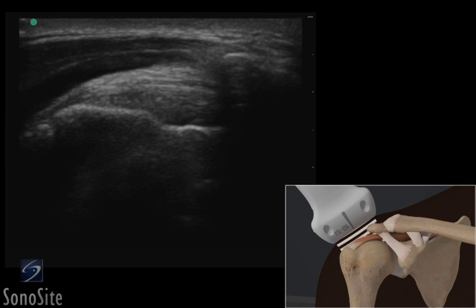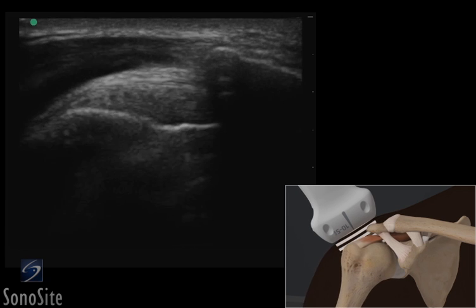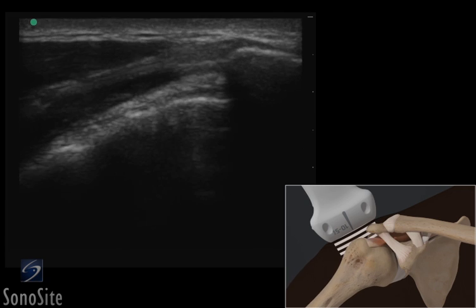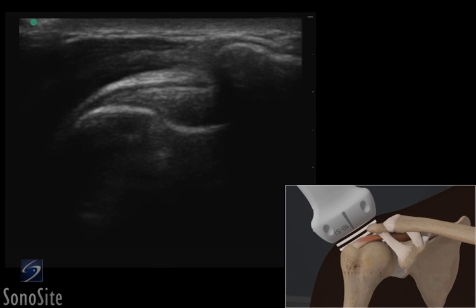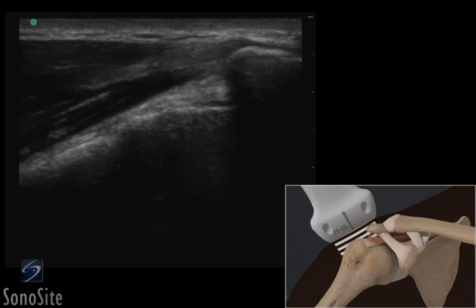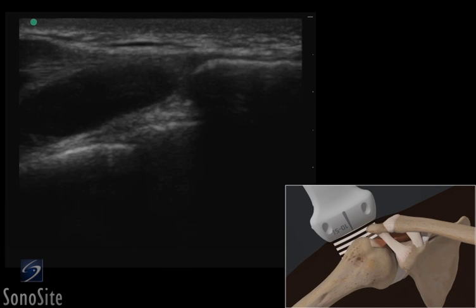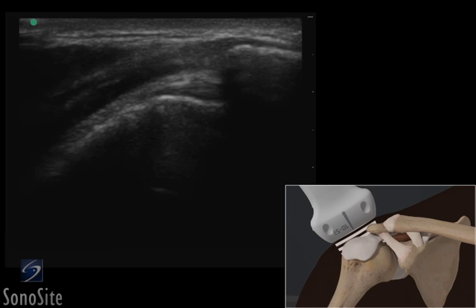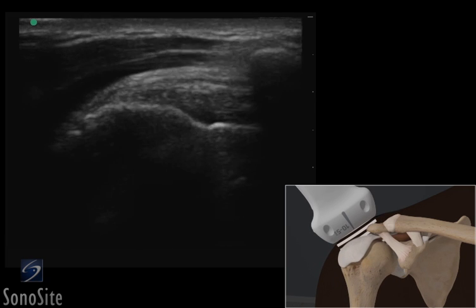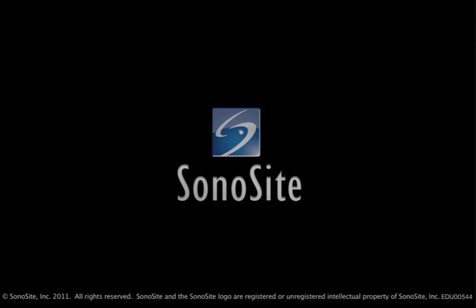The patient is instructed to slowly abduct the arm to evaluate the dynamic movement of the supraspinatus tendon and bursa under the acromion. The structures should pass under the coracoacromial arch without the humerus impacting the acromion, or without the subacromial subdeltoid bursa bunching up with full abduction of the arm, to exclude acromial impingement.